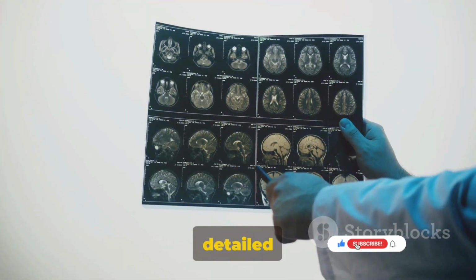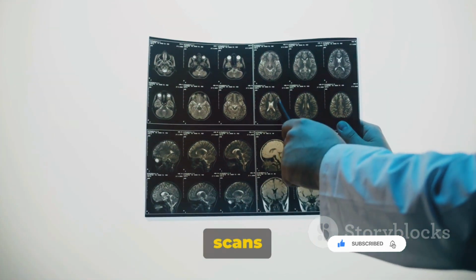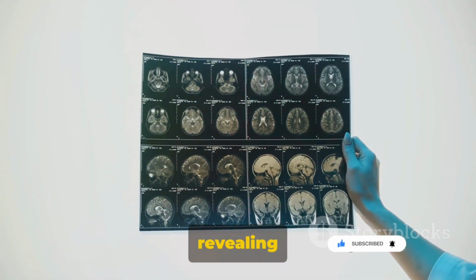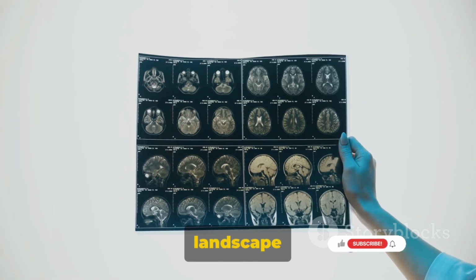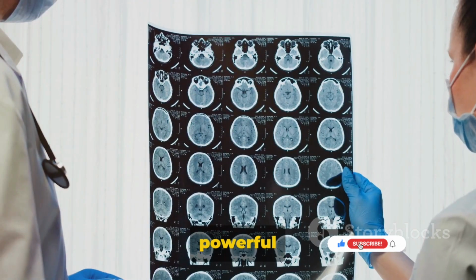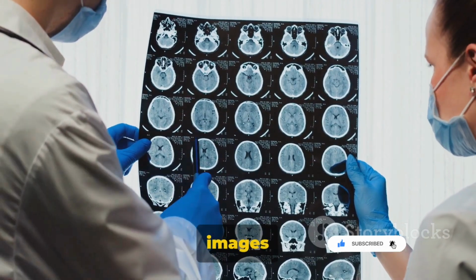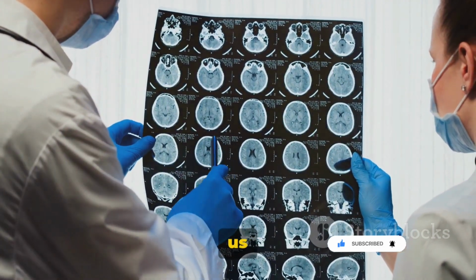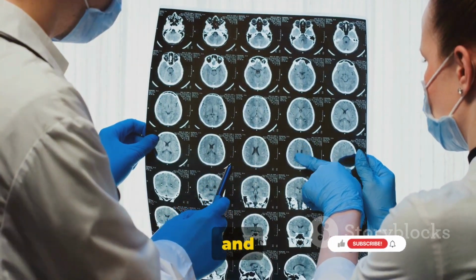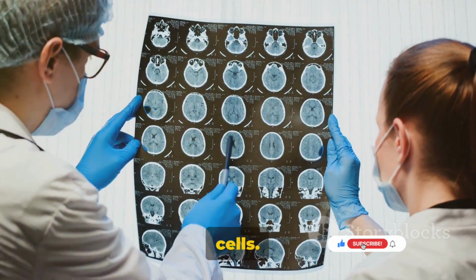Imagine you could take a detailed snapshot of the brain's structure. That's exactly what MRI and CT scans do. These two techniques are cornerstones of structural neuroimaging, revealing the intricate architectural landscape of our minds. Magnetic resonance imaging, or MRI, uses a powerful magnetic field and radio waves to generate detailed three-dimensional images of the brain. This allows us to visualize both gray matter, where the brain's neuronal cell bodies reside, and white matter, the highways of nerve fibers that connect these cells.